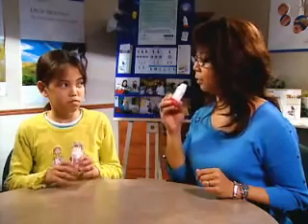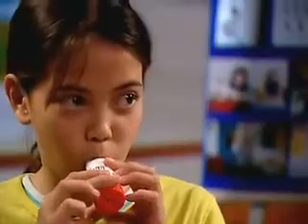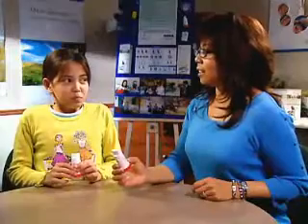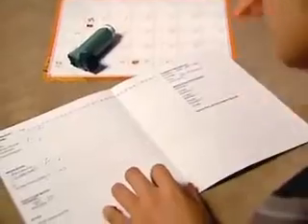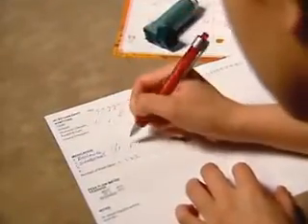Children should also receive ongoing coaching about the importance of inhaling strongly and deeply, a tight mouth seal, and counting slowly to 10 before releasing their breath. Older children should be encouraged to keep track of the doses used and mark down in a calendar the date they will require a new device.